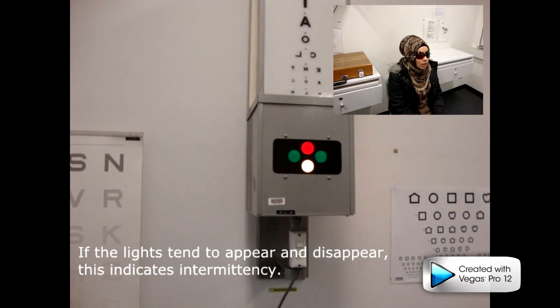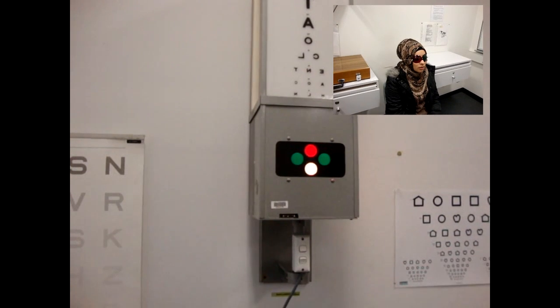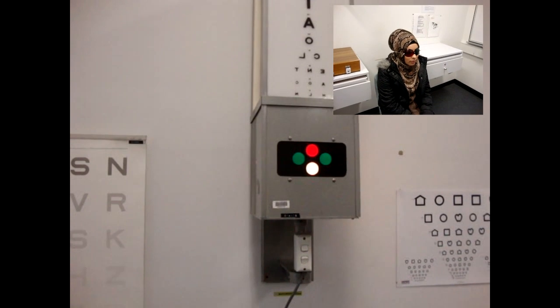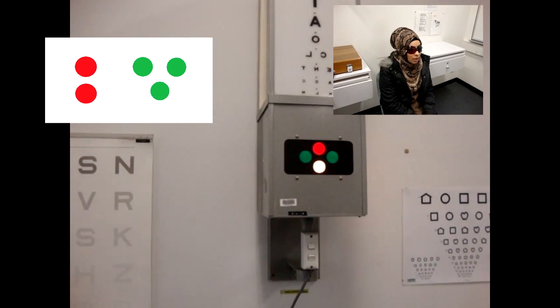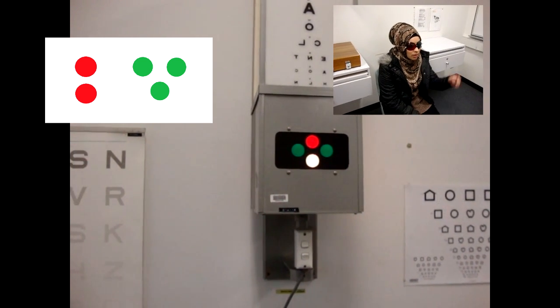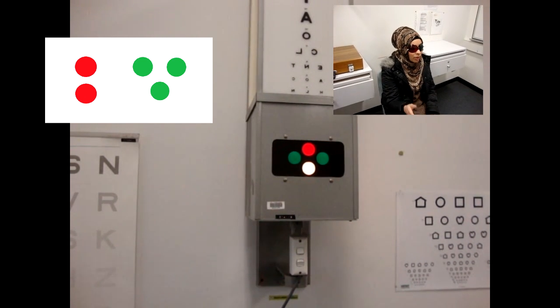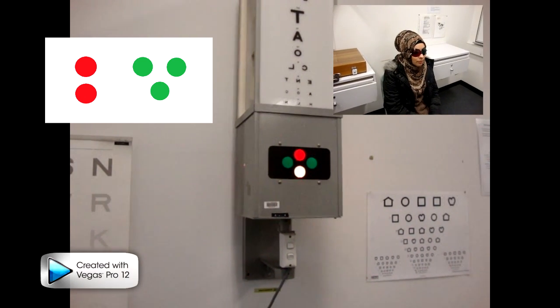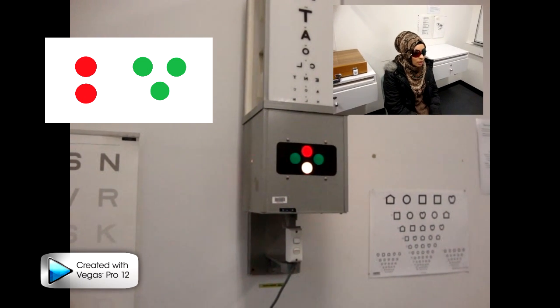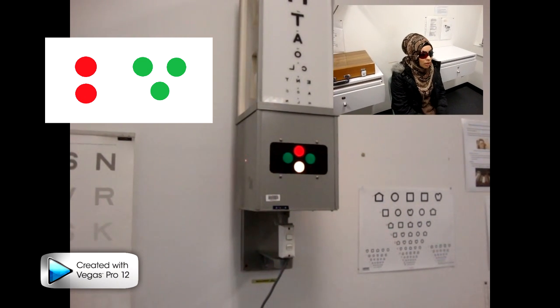Now, where are the green lights in relation to the red lights? The green lights are on my right side and the red are on my left. This suggests that the patient has cross diplopia. How far apart are the 2 lights? They're pretty close to each other. This indicates that the deviation is small. Is there any height between the 2 lights? For example, is the red set of lights higher than the green, or is the green set of lights higher than the red? No, they're pretty much on the same level. This suggests that the patient has no vertical deviation. Okay, thank you.